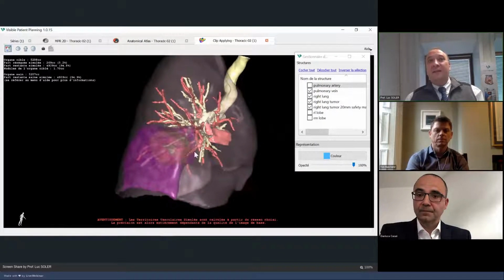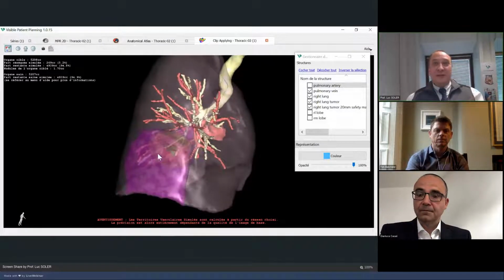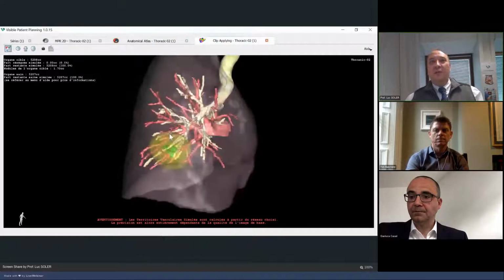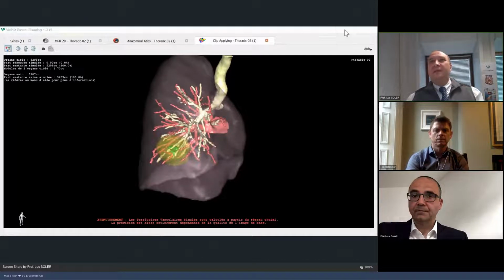She has resected this subsegment 9. It was possible, but of course, when you look at the shape of this subsegment 9, it looked like a normal segment 9. Don't forget that the patient already had a lobectomy before. So you see here again a possibility offered by the software with this 3D reconstruction, allowing you to see perfectly the anatomy, the patient-specific anatomy of the case.